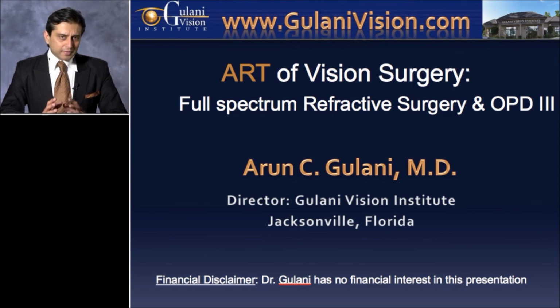So shortly I will share with you a few case scenarios where we'll go over these concepts and how you go about it. But talking about technology, I think the need of the hour has been something like an OPD-3 that would bring in all this data in one platform. So a patient sitting at one single station, we can detect all this information, take it to us in the consultation room, and show the patient on screen what exactly you're seeing.